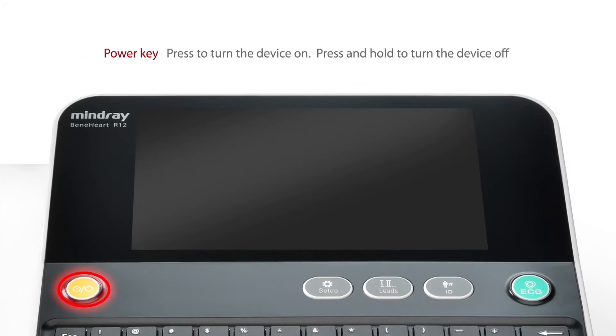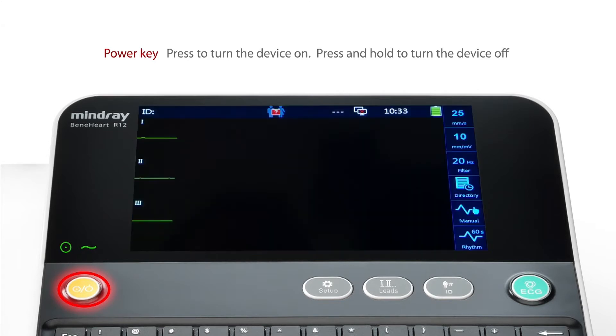Press the power key to turn the device on. Press and hold the power key to turn the device off.